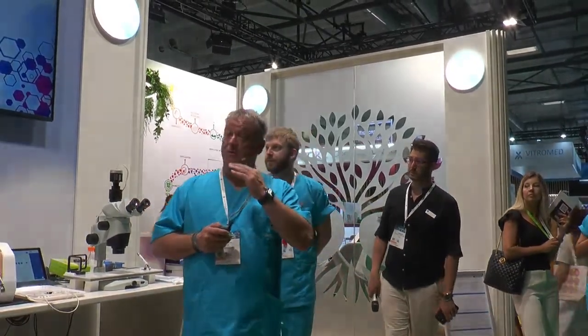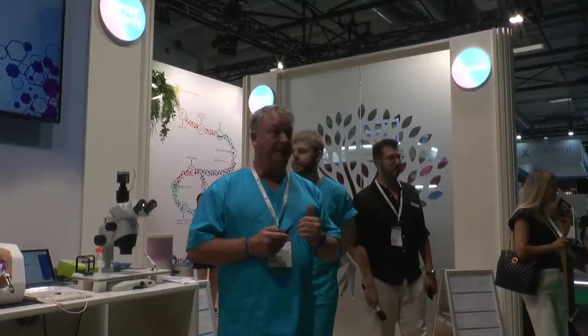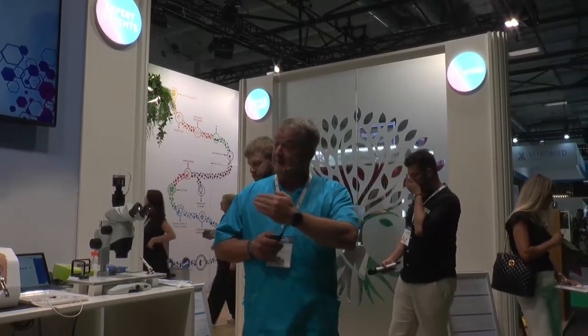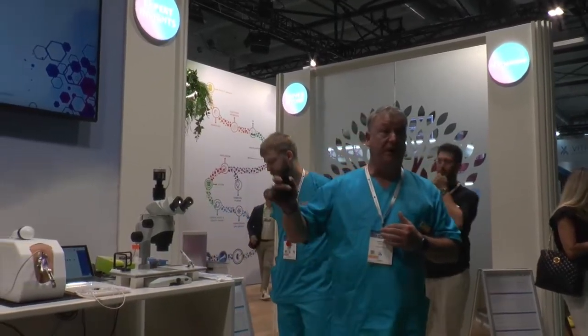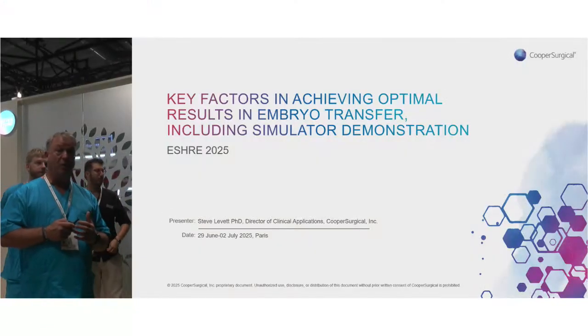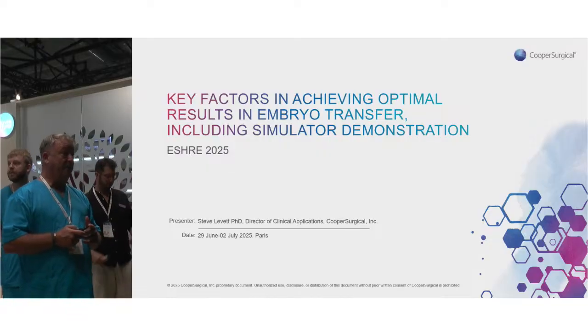So we're first going to do a few slides to build up the background. Then Anton and I are going to talk through one way of loading an embryo transfer catheter, and then we're going to do a demonstration on our simulator here to try to highlight some of the key points when you're doing an embryo transfer.